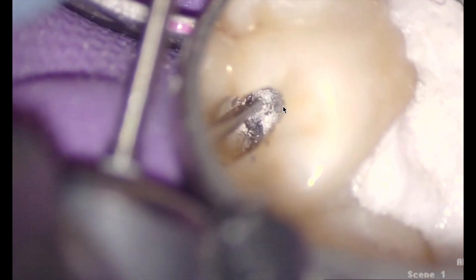I also trough towards the palate to make sure there's not an extra distal buccal canal. Interestingly, in the footage after I rinsed with sodium hypochlorite and cleaned all the debris up, I actually saw where the mesial buccal was — I didn't see it while I was doing it. It's right there. I actually found the MB2. So that's the second tip: go slow, and use really long shank burrs so the head of the handpiece is way out of the way so you can see what's going on.